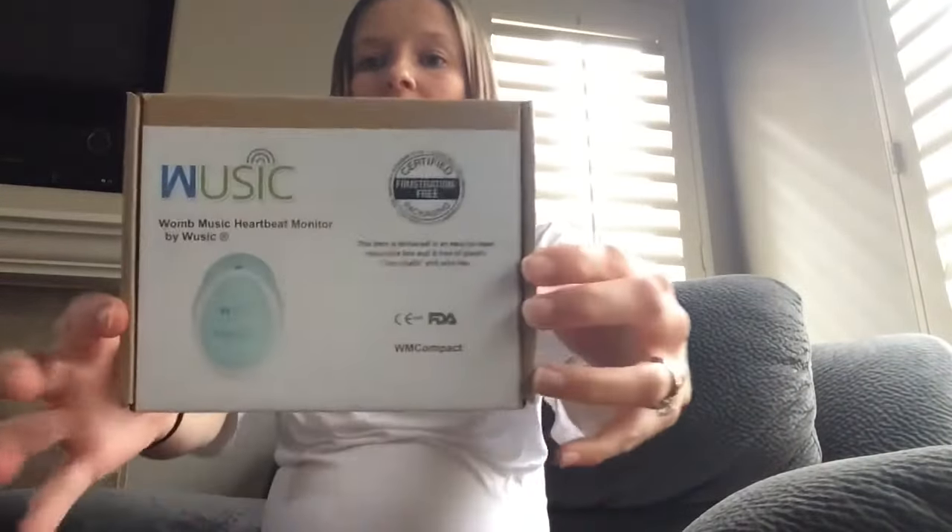Today I'm going to do a review of the Womb Music heartbeat monitor that I ordered — it's a fetal Doppler. I bought it when I first became pregnant because I was super worried in between doctor's appointments about the baby in general. I wanted something I could use to check on her all the time and make sure that she was okay, especially before I could feel her moving around. Right now I'm 31 weeks pregnant and I can feel her moving all the time.